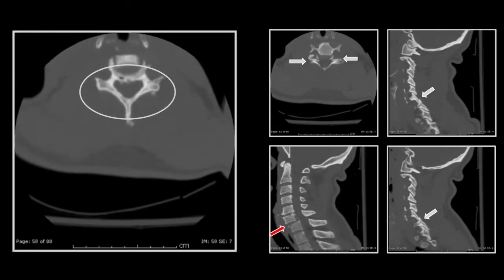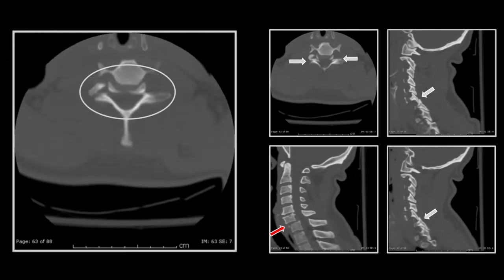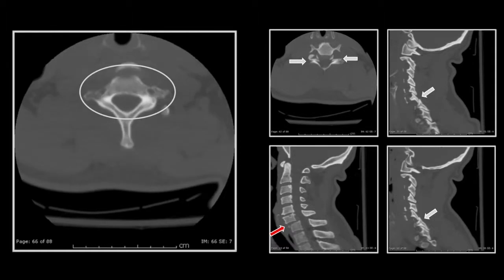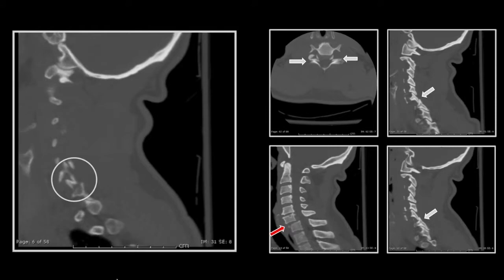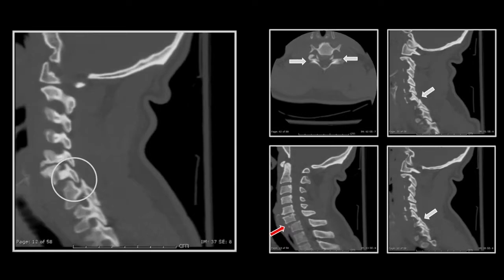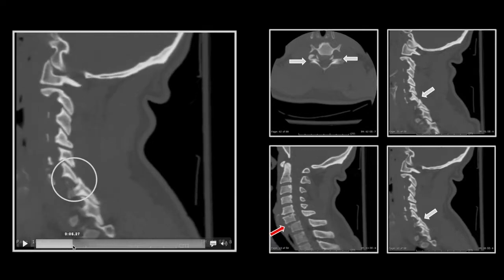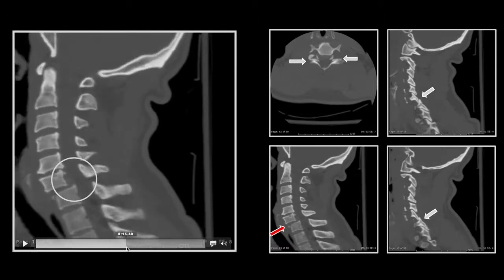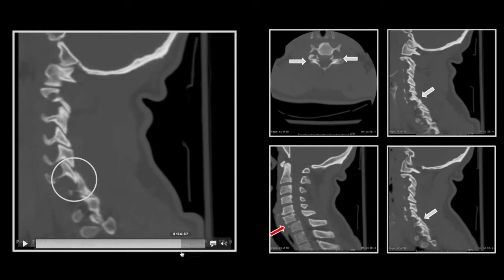This is the kind of pattern recognition that's critical on the axials — reversal of the normal relationship of the facets. On the sagittal, this is always best appreciated. You can see there is fracturing of the superior articular facet of the level below, which is a frequently associated injury. There is locking of the remainder with anterolysthesis. On the other side, we have the jumping and locking without the fracture.